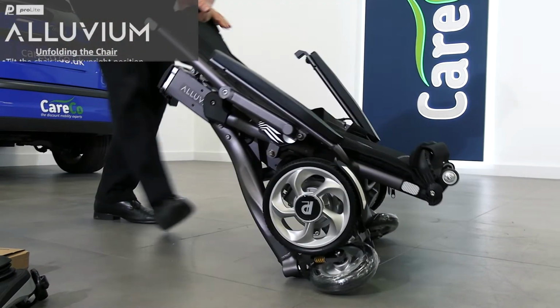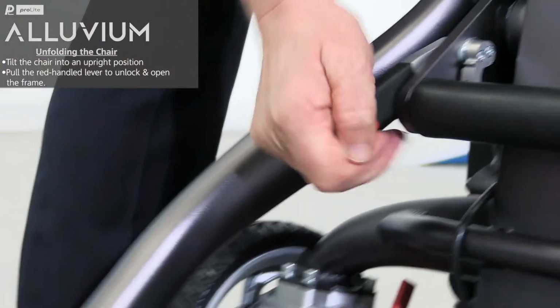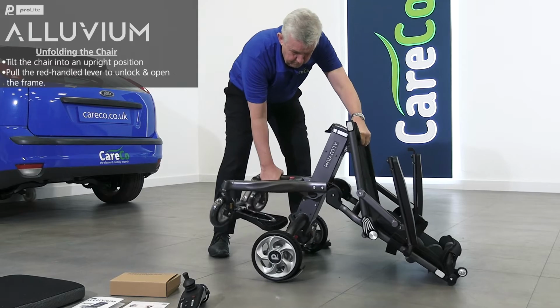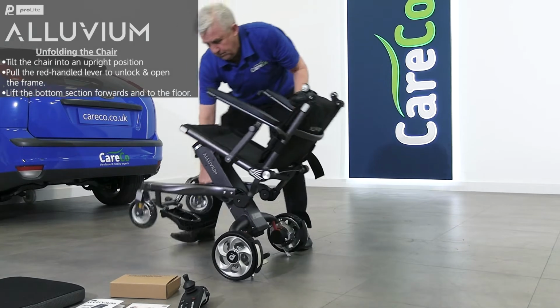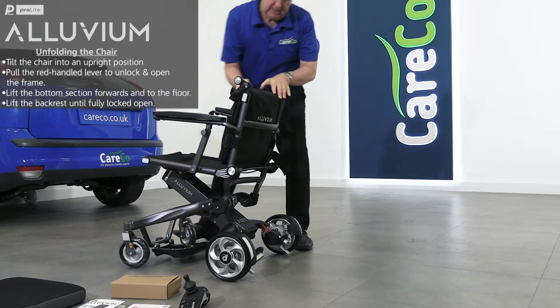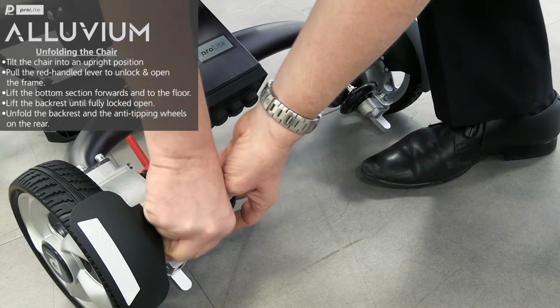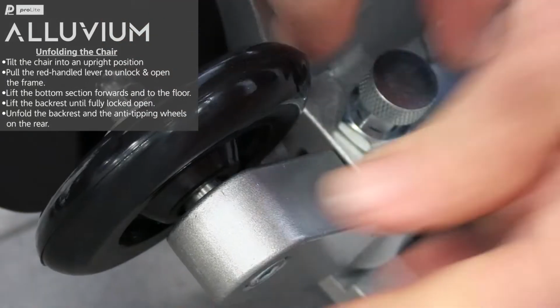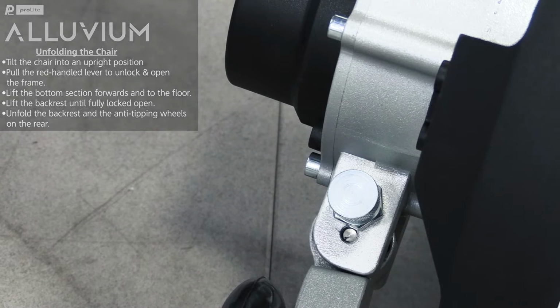Tilt the chair into an upright position, then pull on the red-handled lever on the underside to unlock and open the frame. Lift the bottom section forwards and to the floor. Then lift the backrest until fully locked open. Now unfold the backrest and the anti-tip wheels on the rear. The anti-tip wheels can be unlocked by lifting these small silver levers.